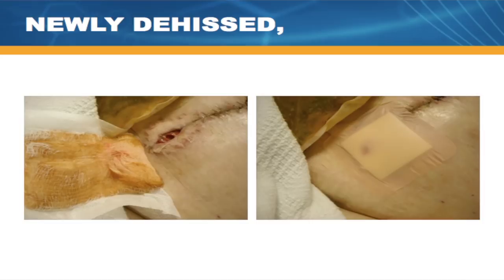This is just an example of a dehisced surgical wound that doesn't look so bad when you're looking at the actual wound itself, except for the fact that it's now a wound and not closed. But look at the amount of drainage on this gauze dressing. And this was from less than 24 hours. So, significant amounts of wound fluid. When they did switch to an absorptive modern day adhesive foam dressing, it was able to absorb significantly more amounts of fluid than your gauze dressings and be able to maintain it intact for a longer period of time, decreasing the nursing time, decreasing the amount of resources that were then being put into that wound care.